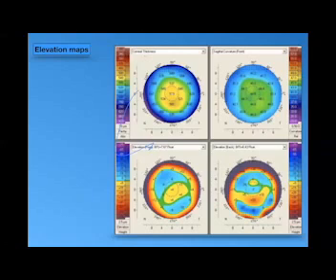Yeah, do you go for ablation or not? If we consider this patient as a steep normal cornea, I will go for a flap-related procedure. I will ablate. You will be worried about buttonholing when using the microkeratome.